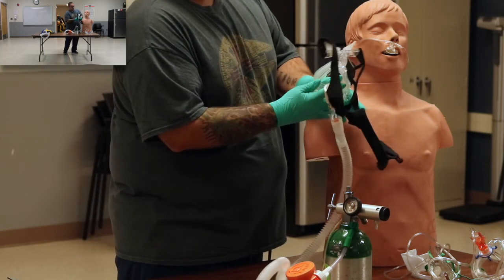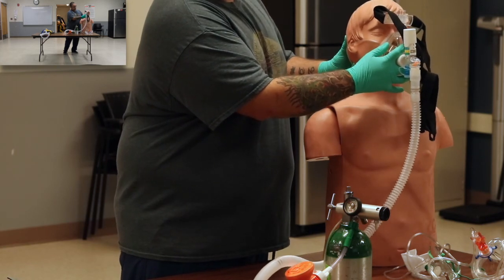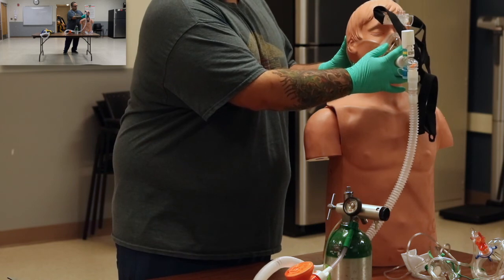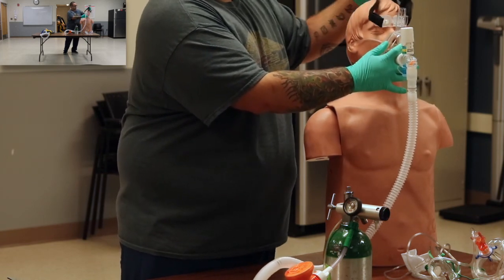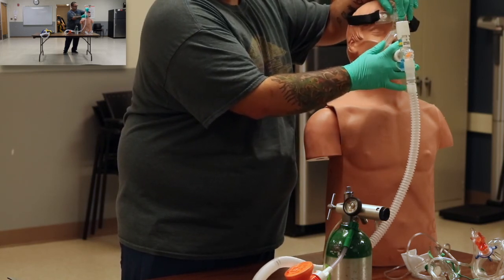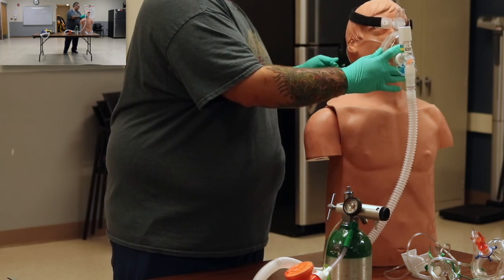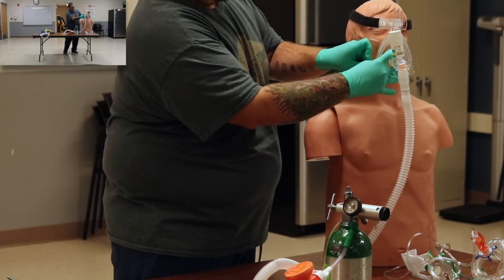So same way, we'll bring it up, get a good seal, and instruct the patient to take a few deep breaths in. If they are able to tolerate it, at that point, we will secure the mask. This top part is adjustable so that it sits nicely across the forehead. And then we have our side straps.